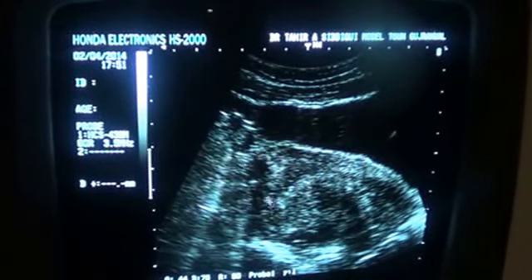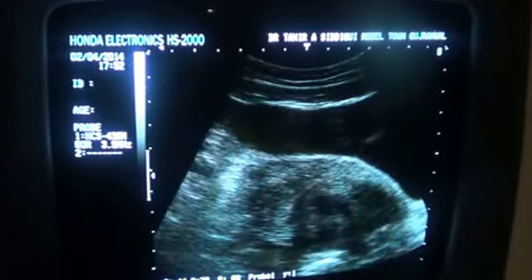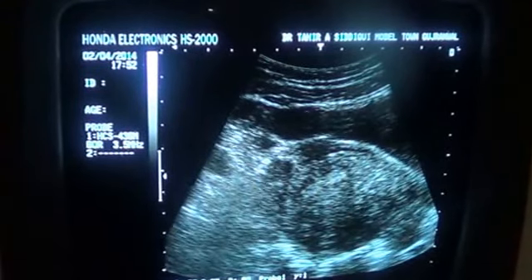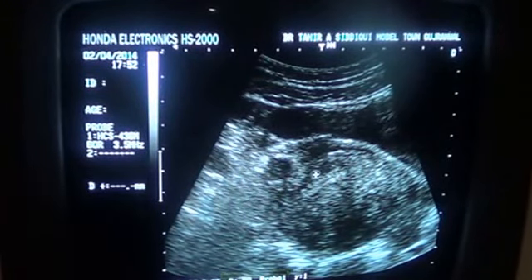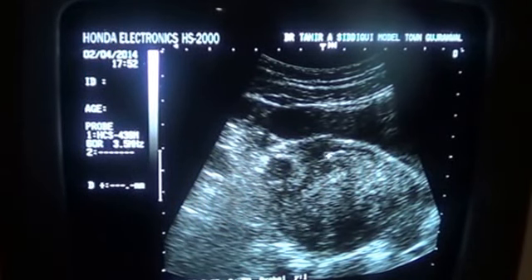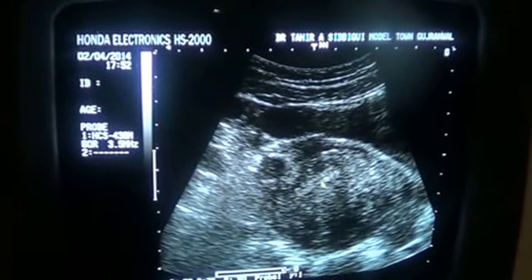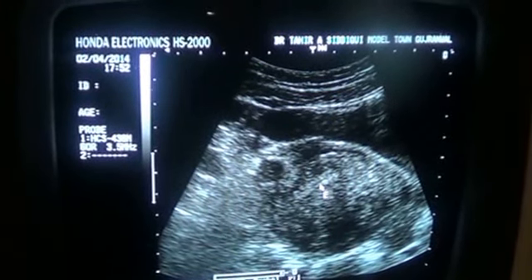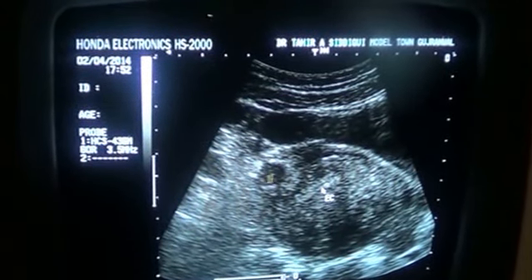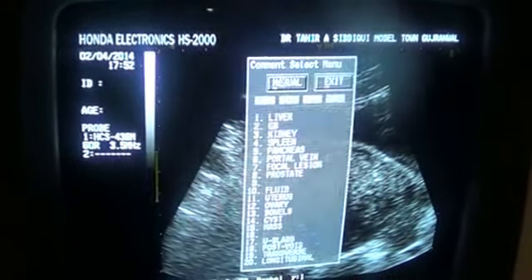This is the fundal region, and this is the longitudinal section. And you can see there are outpouchings from the fundal region as well. This is one, this is two. Now these are fundal region subserosal fibroids. This is the endometrial canal. In this section, it will depend on the view I am taking. And this is a subserosal fundal region uterine fibroid.